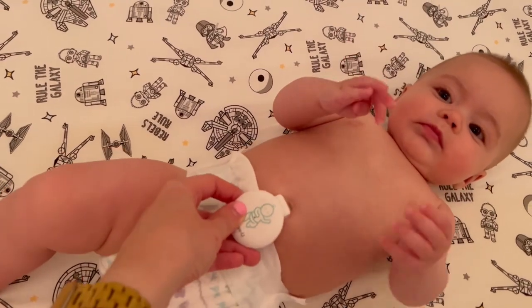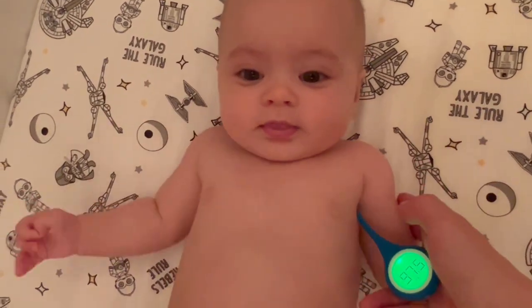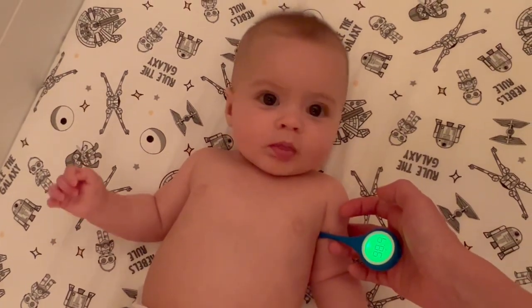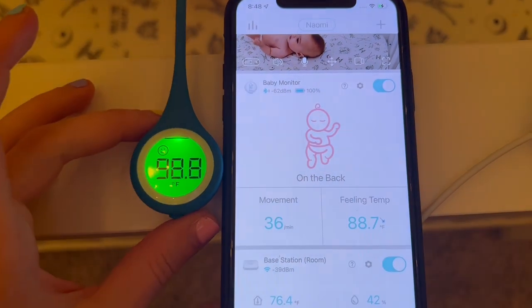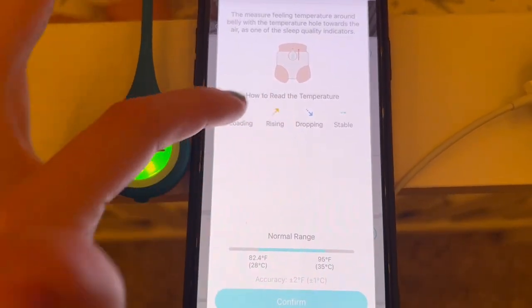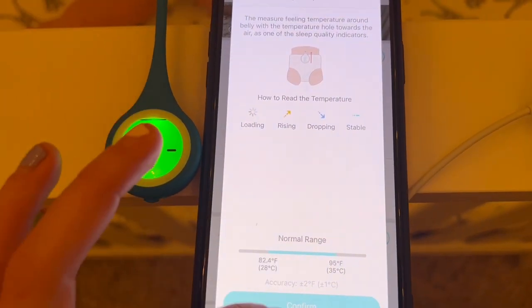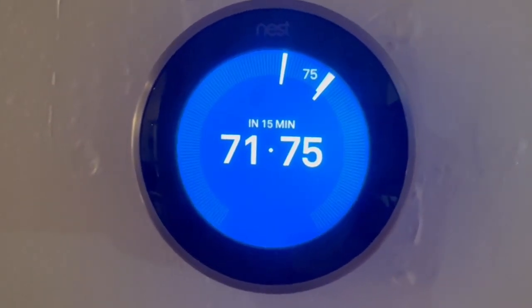I next wanted to try out the baby monitor portion — the thing that you hook onto their diaper — and I wanted to check out the temperature reading portion. I got my personal thermometer to take Naomi's temperature, and the first reading I got was 98.1. I took her temperature again and it was 98.8 — a little variation, which is typical. But in the app it said 88.7, so a little different there. The app said the normal range was 82 to 95, which is a little different than what my doctor has talked about with me, so take that with what you will. The base station said the indoor temperature was 76.6, and my Nest said 75, so I felt that was relatively close.